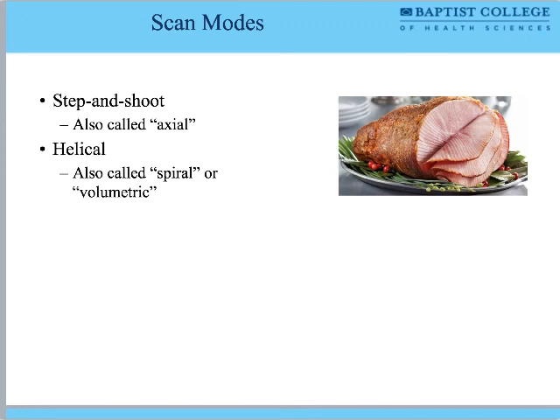Why is that helpful? Well, the short answer is that this is now volumetric data. It represents the entire volume as a single thing in the computer's mind, or the computer's memory, I should say. The volume of data is a single continuous thing. And so if I need to, now I can represent that entire volume of data three-dimensionally.